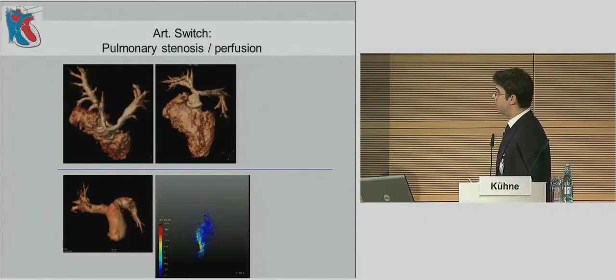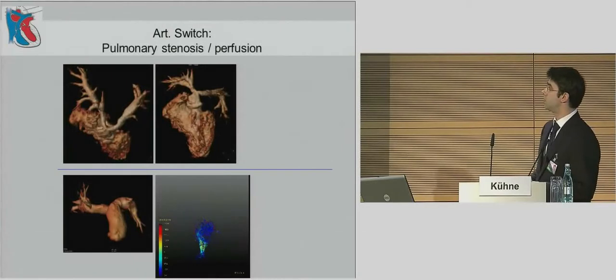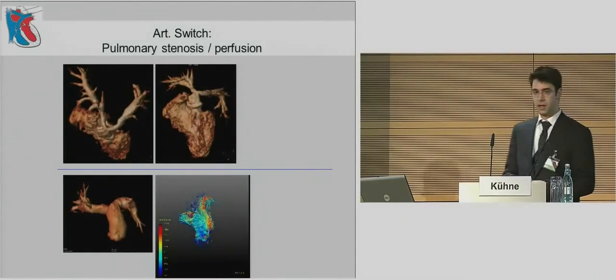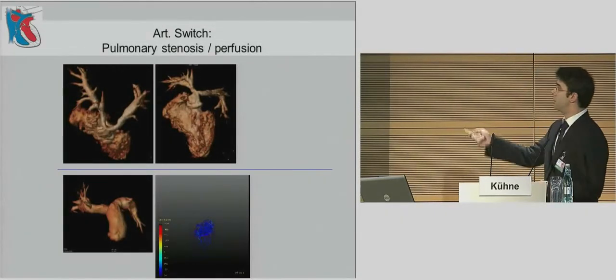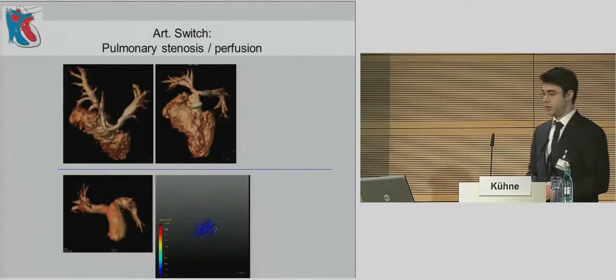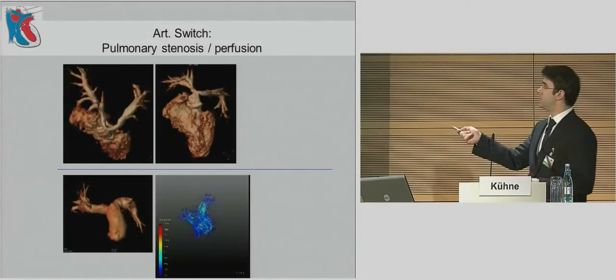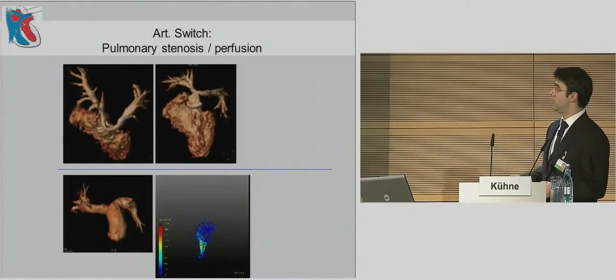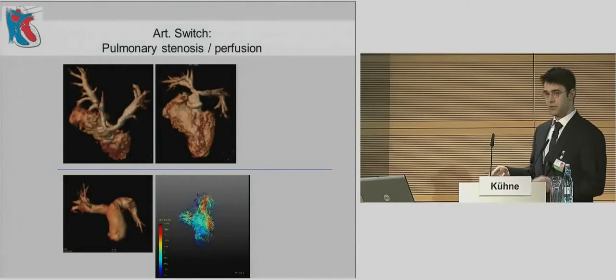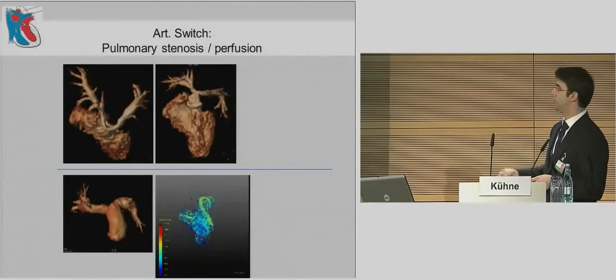So now the switch from the small vessels to the greater vessels. It's much easier to talk there because it's less hypothetical, it's more real. We have seen some of these images. It's now about the assessment of pulmonary stenosis or perfusion. And we can, of course, assume that the blood does not really like to pass through these thin vessel segments, that there might be some deterioration.